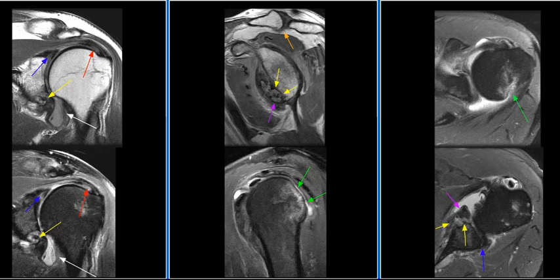This case is a 55-year-old male with a history of recent trauma. MRI examination of the shoulder shows an impaction fracture of the posterolateral humeral head consistent with a Hill-Sachs lesion.